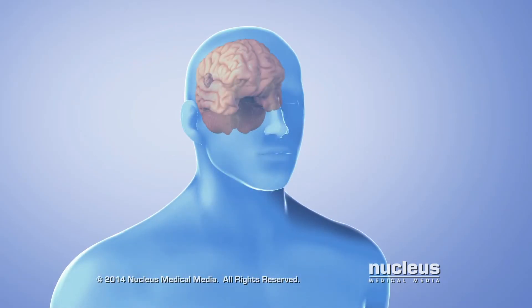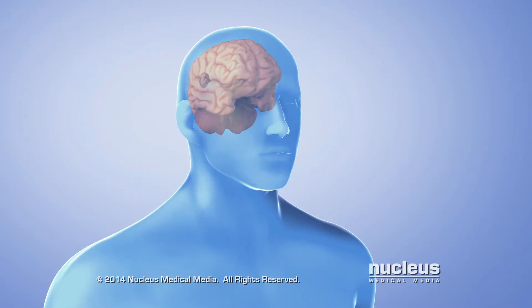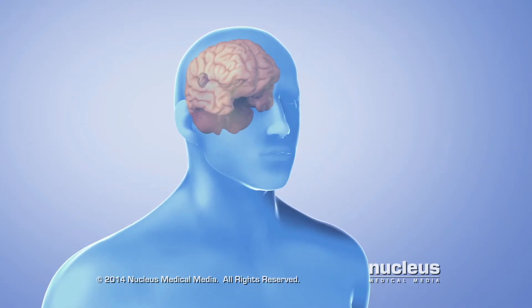The Gamma Knife, also called stereotactic radiosurgery, is a type of radiation treatment used commonly for brain tumors. It may also be used for other abnormal conditions of the head.